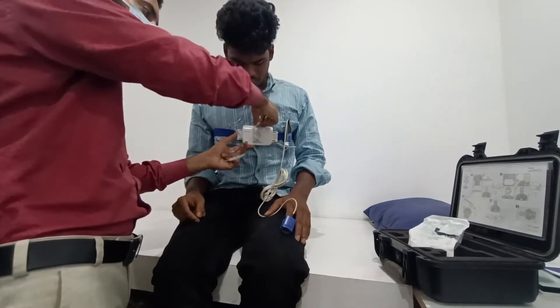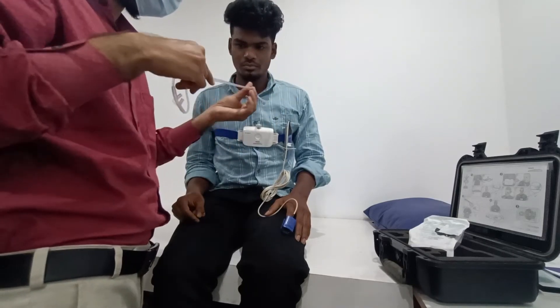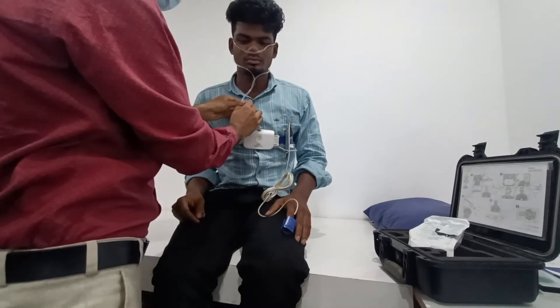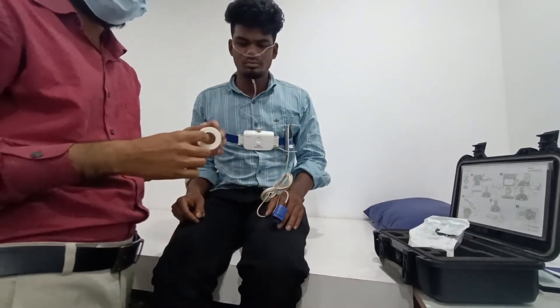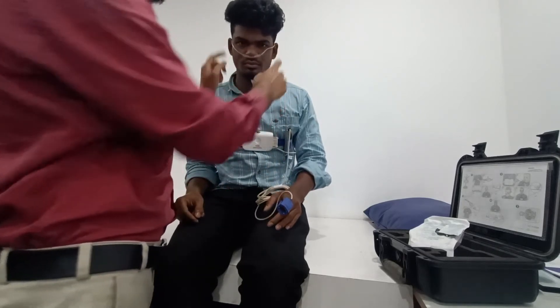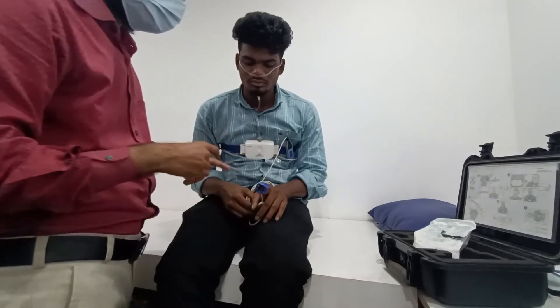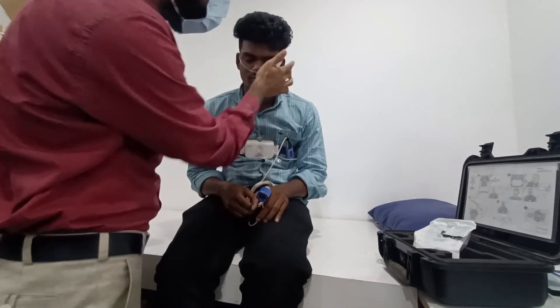Then connect the cannula. Rotate and connect the cannula here, and after that connect it in the nose. You have to use tape to secure the oximeter here and the cannula here. Secure the oximeter by placing micropore tape here.